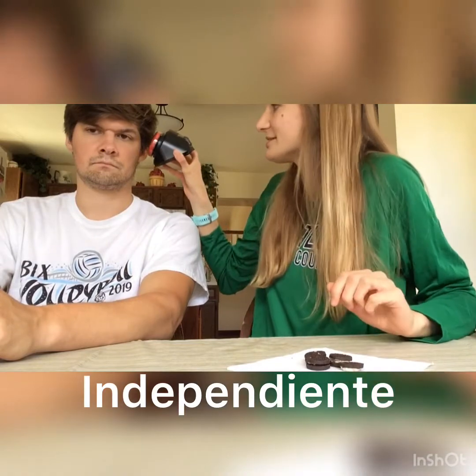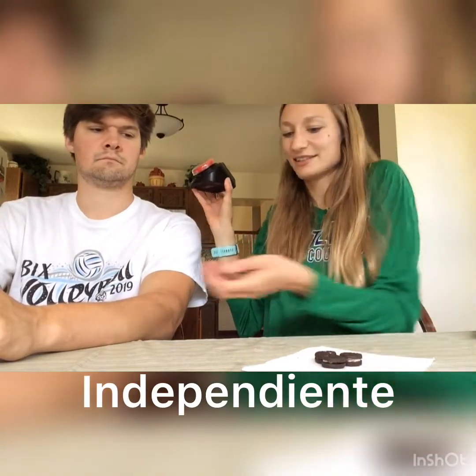Hey, do you want some cookies? Cookies. Nice work.